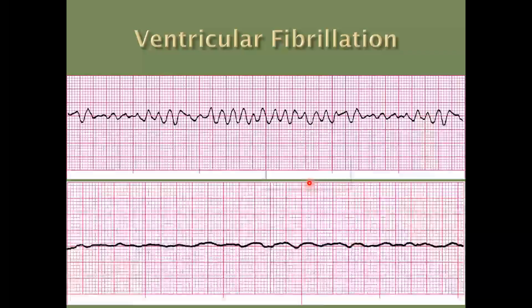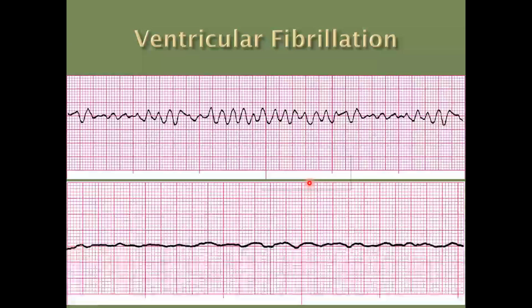Shake the cable. All right, check the patient. Patient's not doing anything. They are unconscious, no pulse. All right, find VFib. So same thing, right? If you have coarse VFib like you have up here, or if it's fine VFib, then it's a shockable rhythm. All right, those are shockable rhythms.